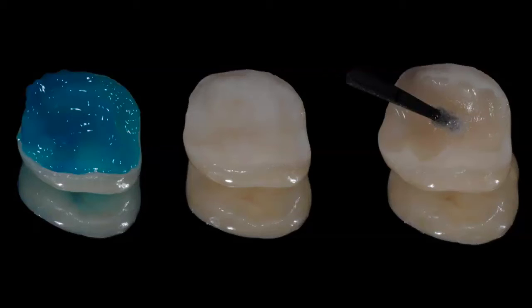Once you remove it from the ultrasound and you bone dry it, now you're ready for that third step that you're seeing on this photo on the far right-hand side, which is the application of the silane. That application of the silane is just one coat of silane within that intaglio surface of the restoration. Allow the ceramic to absorb some of that silane, and then with a gentle stream of air, you can go ahead and eliminate the solvent. The most important aspect is that the interaction between the silane and the intaglio surface of the restoration should be no less than 60 seconds.